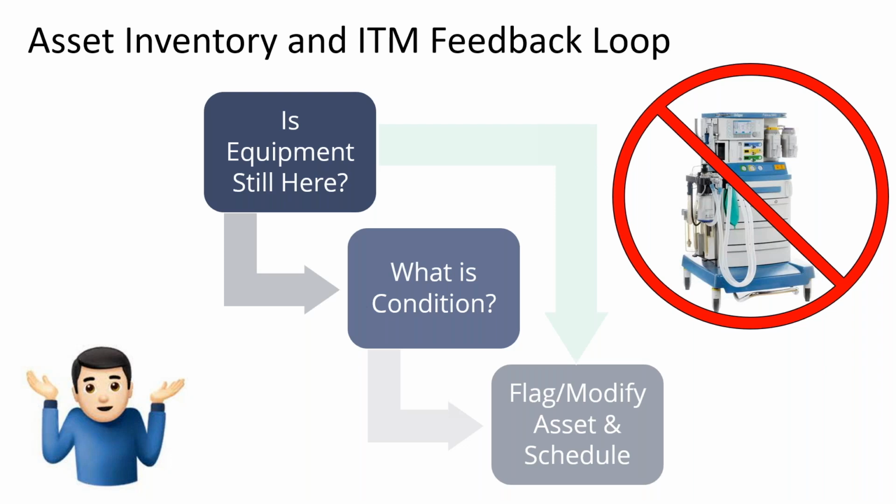So one is, did you find the equipment? Is the equipment in operation? Is it hooked to a patient right now? Can you ask those types of questions? And then based on those questions, change things about that piece of equipment, that work order, that status.